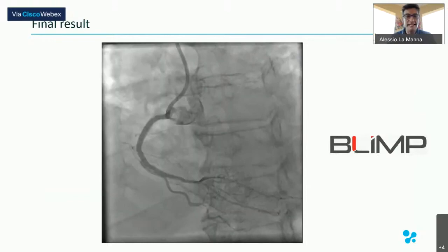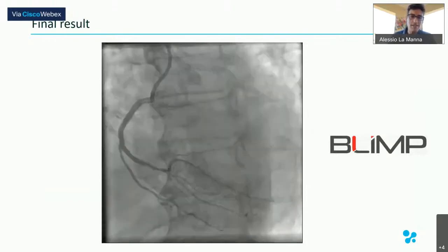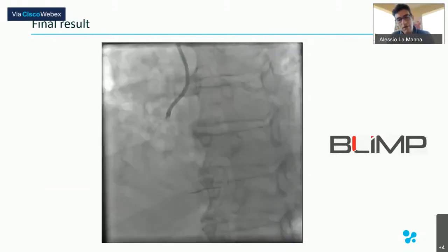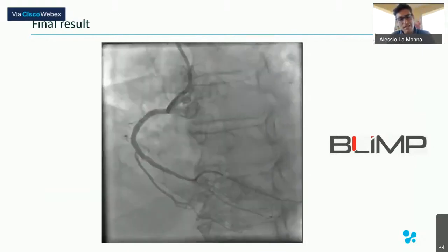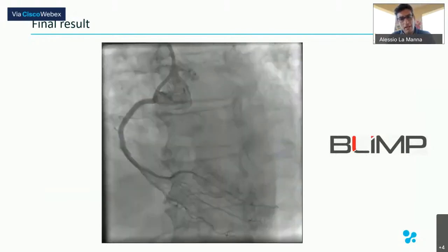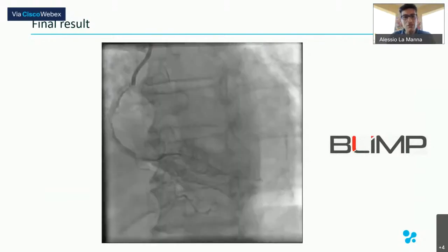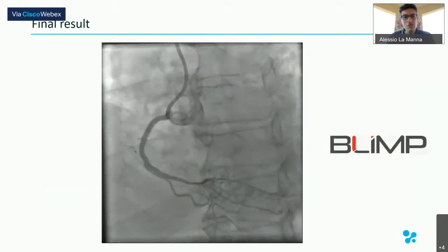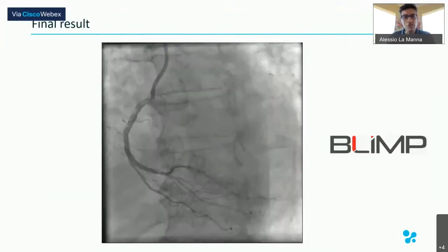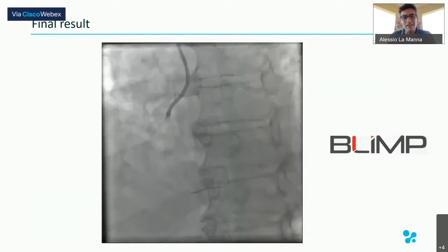And nowadays, with the new devices that we have shown in these wonderful cases that you and Gabriele performed, we have understood how important it is to have such versatile devices that can be used, like Recross, the single microcatheter that can be used for any kind of scenario, from Antegrade wire escalation to parallel wiring to bifurcation CTO to re-entry.